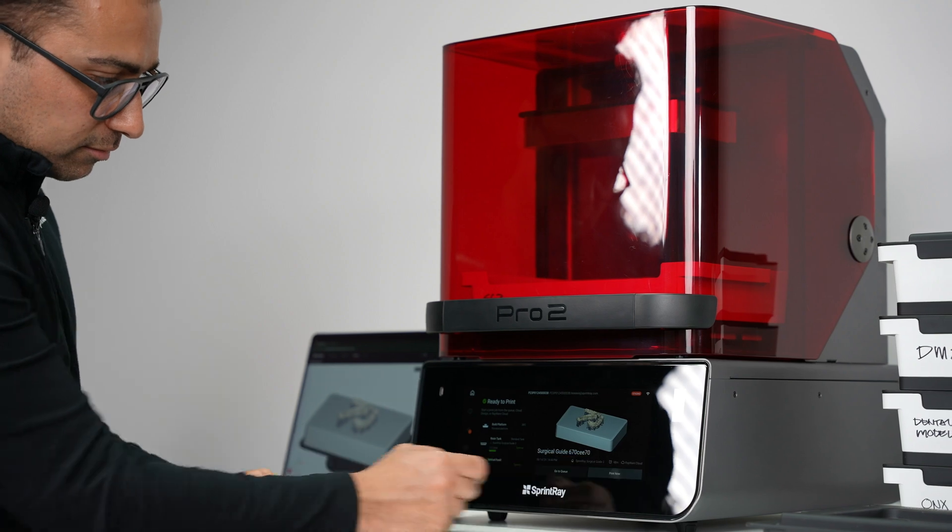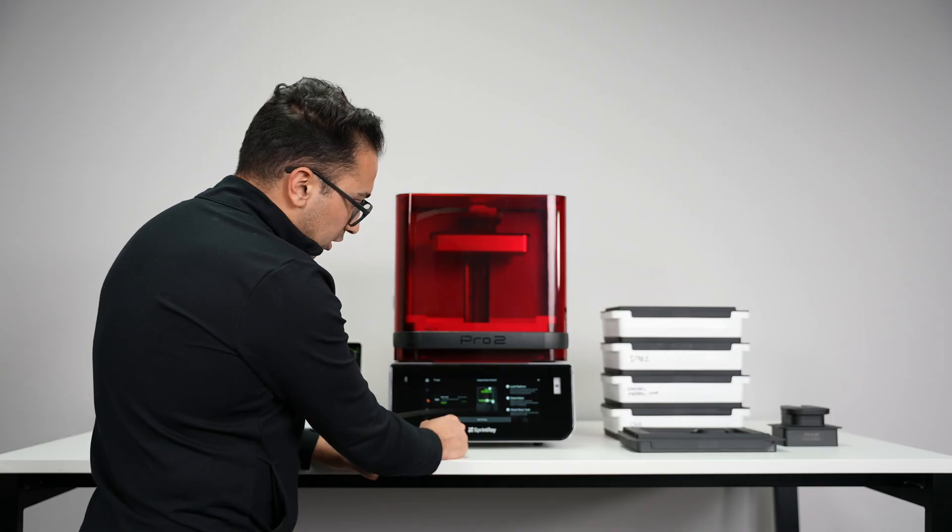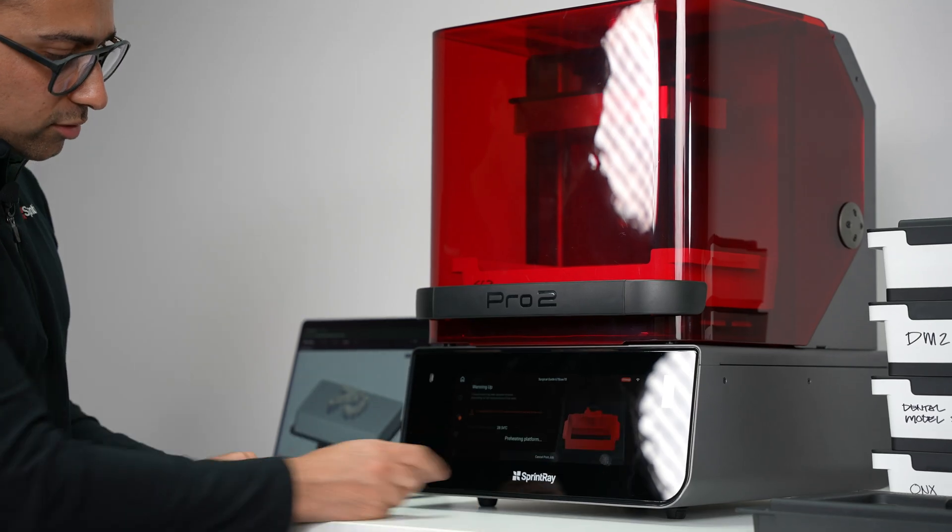Tap on print now. Follow the instructions on the screen to make sure everything is ready to go, then tap on start printing.